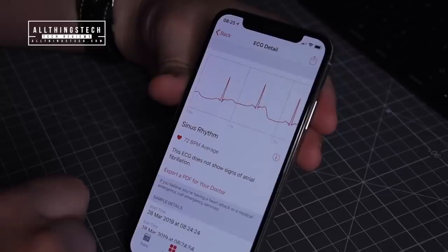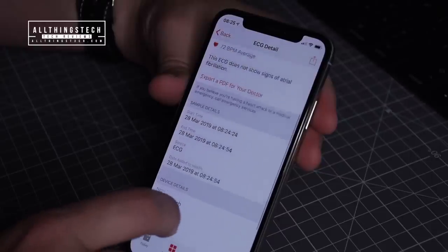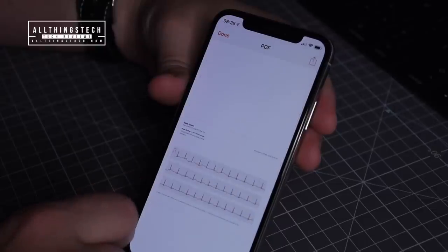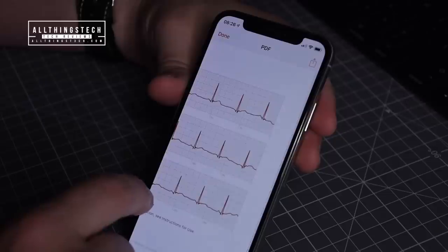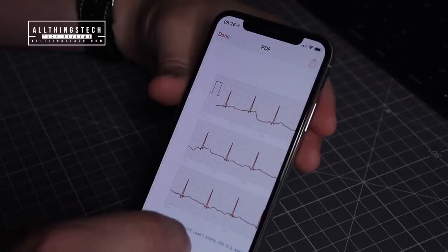The reading confirms you don't show signs of atrial fibrillation, and it also gives you the option to export it to your doctor as a PDF. The export includes the time, the device, and all relevant details. When you click Export, it presents a far more detailed version of the ECG that was taken.